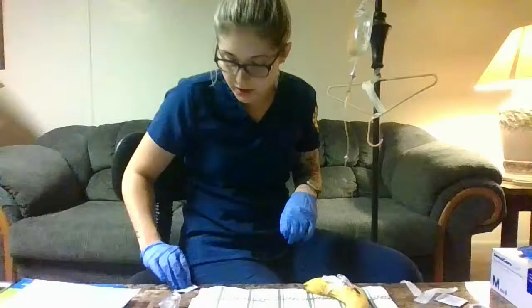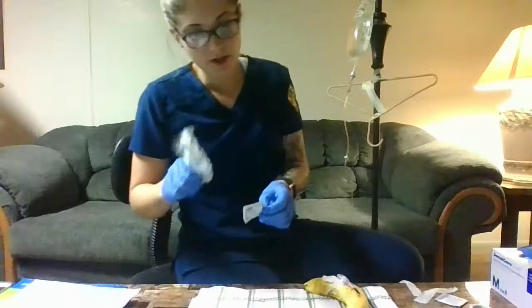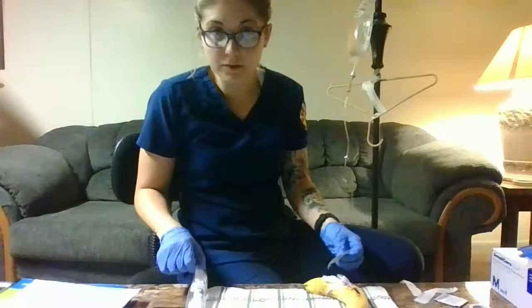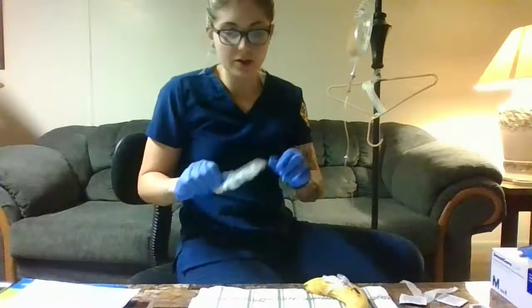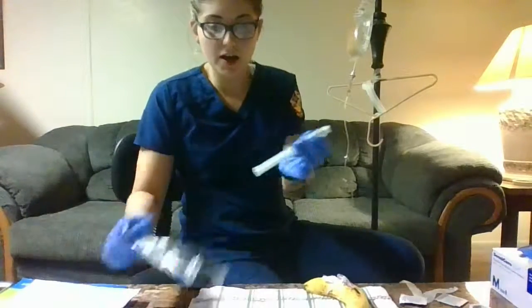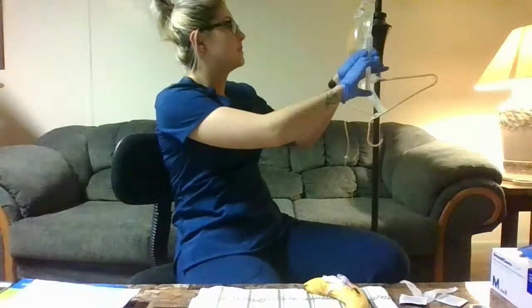You have your supplies. So you have some alcohol swabs and you have a saline flush. So you're going to clean the site here with the alcohol swab. Allow for time to dry, and while that's drying, you can open up your flush, take your cap off.